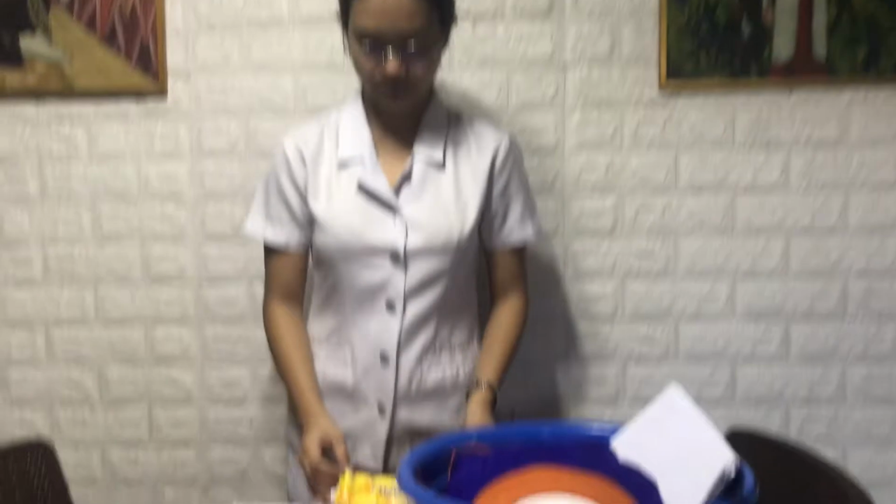Next is the perineal pad. Then the gloves, the surgical gloves, the bedpan, the newspaper. So this newspaper will serve as the cover for the bedpan. And lastly is the draw sheet. Since I don't have that kind of materials as well, let's just use this instead. So after preparing all these materials, let's go ahead and do the hand washing.